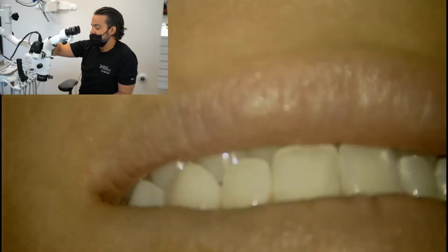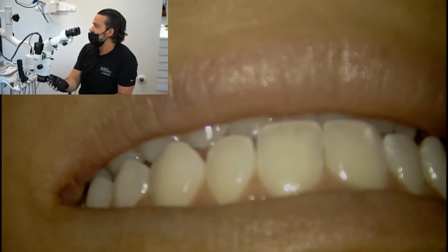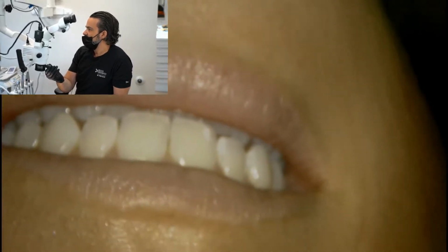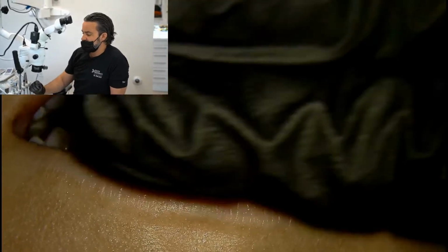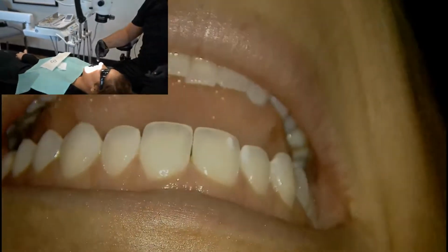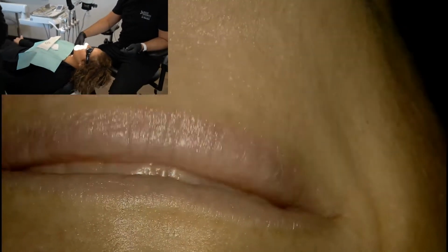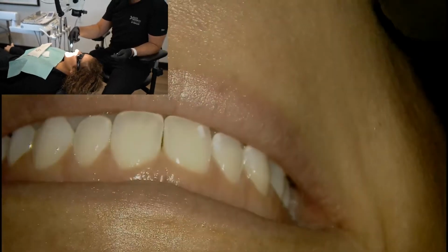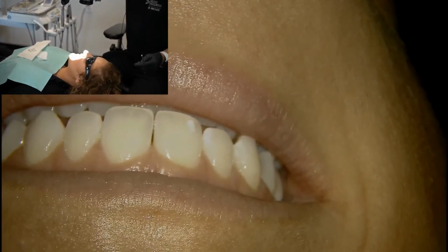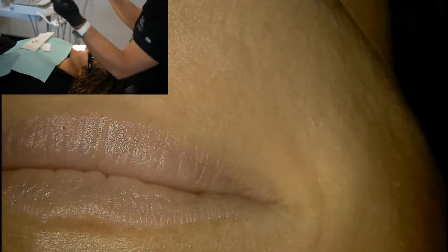If I were to crank this up, this monitor is going to actually filter some of this brightness out just by the way that our technology is in this room. But it can get really warm. Can you feel the heat? See, she's getting a suntan. And this one's got the olive skin. She likes that. I think it's her Greek blood. You'll feel the warmth of that. And I'm on full power now. So it's just little things to think about.